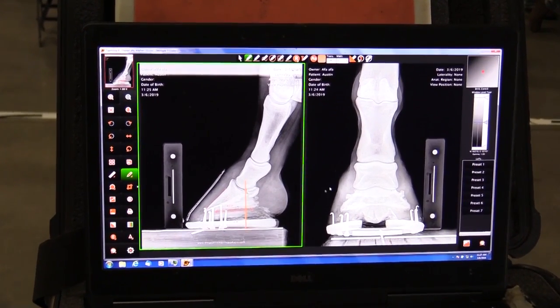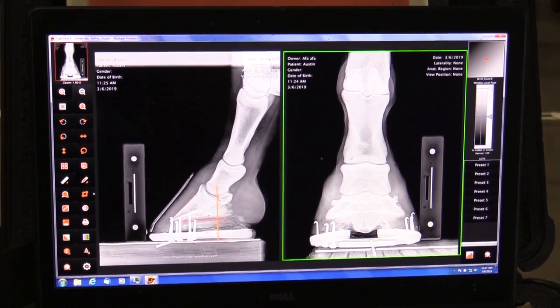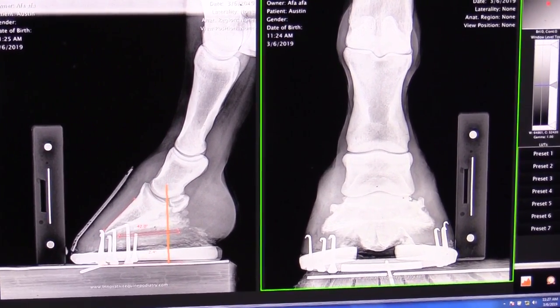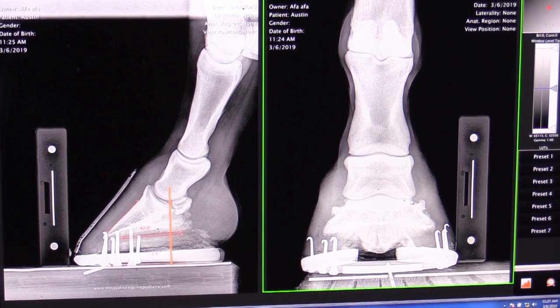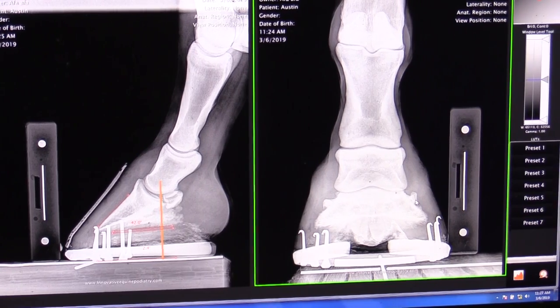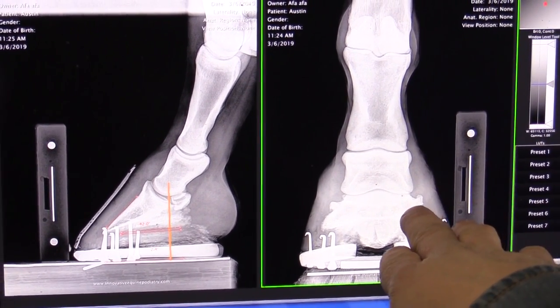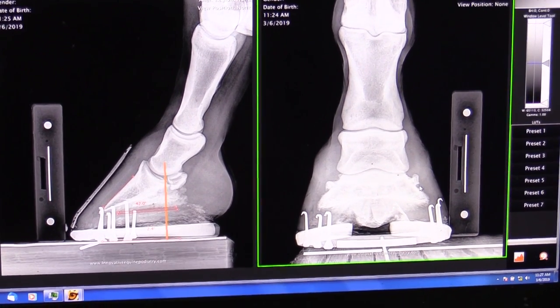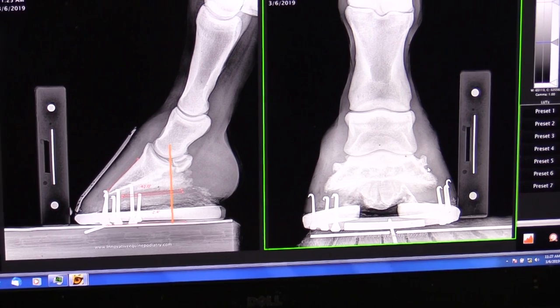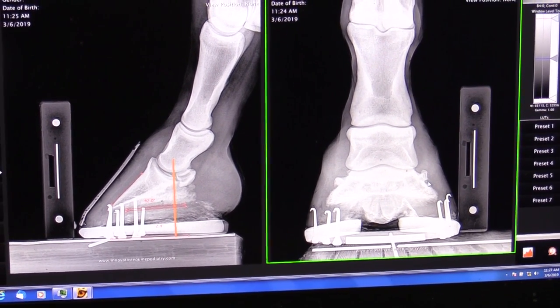If we look at his coffin joint spacing here on the dorsal palmar radiograph of the left front, we see our joint spacing laterally is a little tighter than it is medially. In this case, we'll pick up that foot and sight down the limb, and I would want to drop the horse on the outside of my trim today to try to level the coffin joint. If this horse had a quarter crack on the medial side or was foundered on the medial side, I would leave that joint out of whack to help unload the medial quarter.